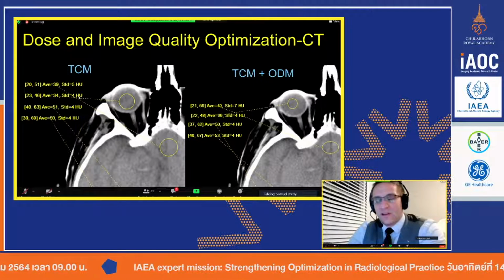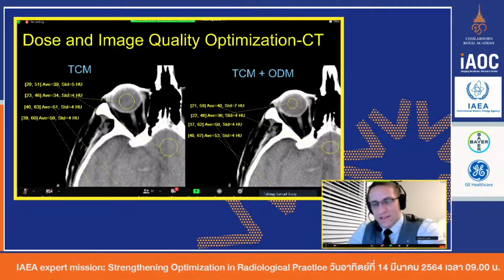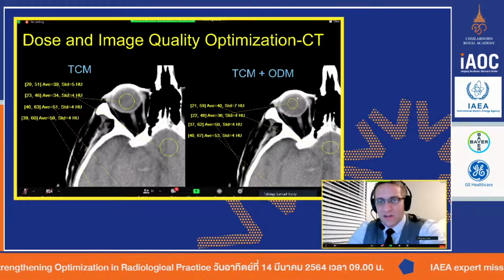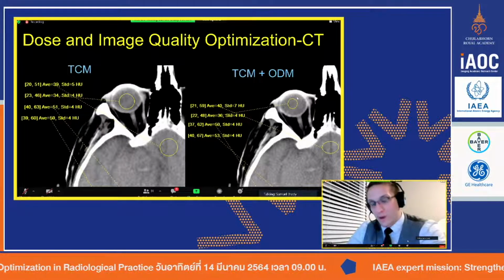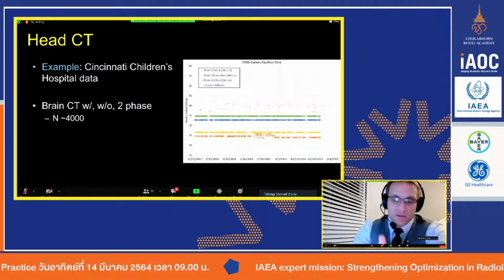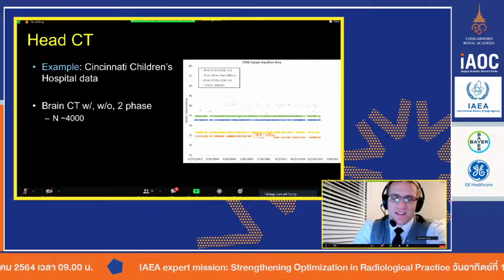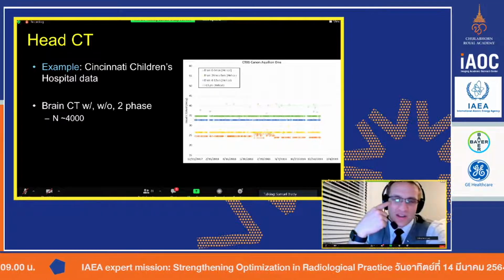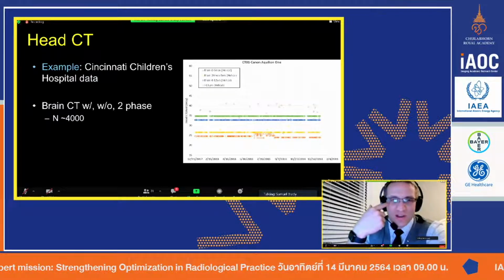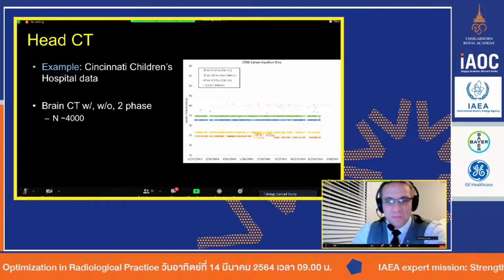So metric-wise, mathematically-wise, it isn't. Visually, you could probably say it's just a little bit, but in our practice of using this, the radiologists have never ever complained, and they've never ever said anything negative about it. And so I think the change depends on maybe your sensitivity as a radiologist. It's hard to say that you'd really see a difference, but you may.